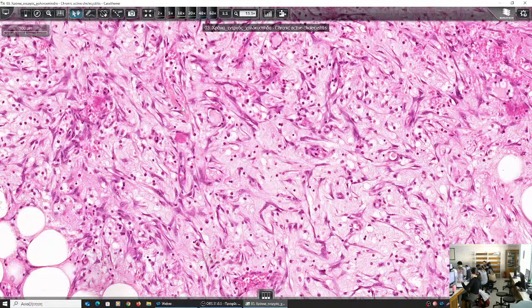So it's interesting why the patient had surgery, because surgeons prefer to remove organs that do not have acute inflammation, because due to the surgery, perhaps the inflammation can go to the peritoneal cavity and cause a complication. However, if a very serious and dangerous complication is imminent, meaning that the whole gallbladder is filled with pus and may break, it's necessary to perform surgery at such a time point.